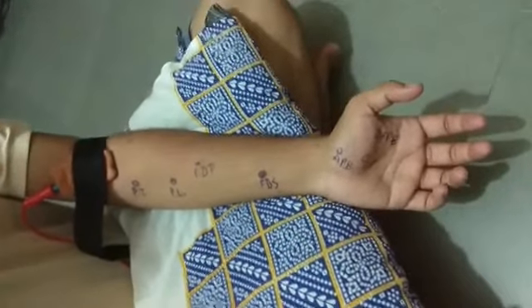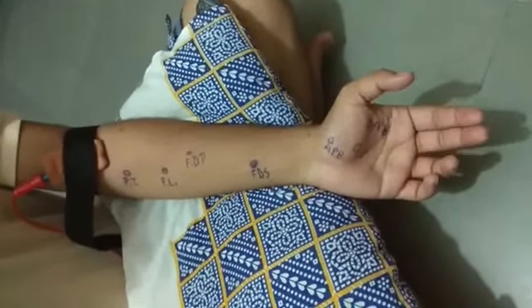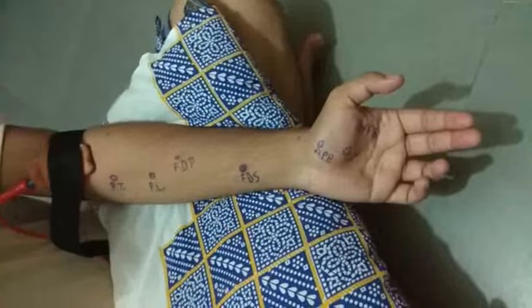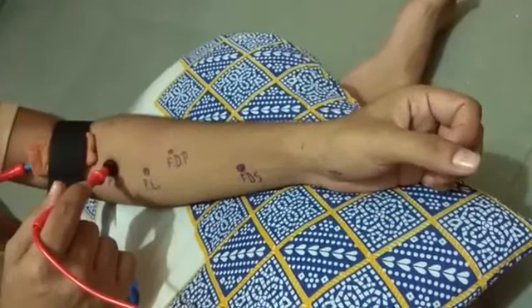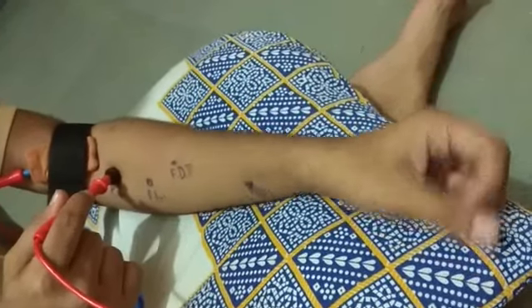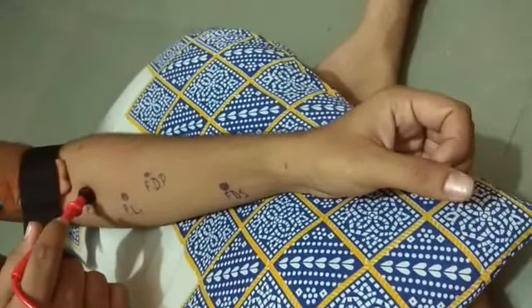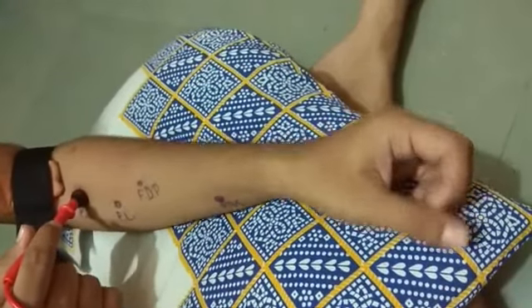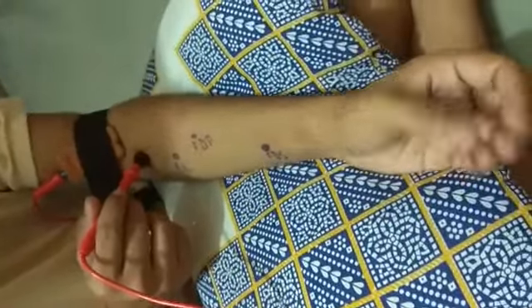The muscles supplied by the median nerve are pronator teres, flexor carpi radialis, palmaris longus, flexor digitorum superficialis, and flexor digitorum profundus. The reference electrode we can put on the cubital fossa. This is the motor point for the pronator teres muscle in surge Faradic current. The action of pronator teres is pronation of the hand.